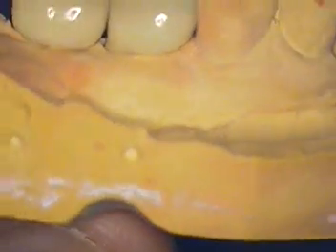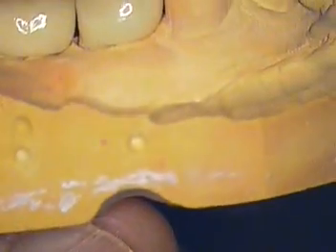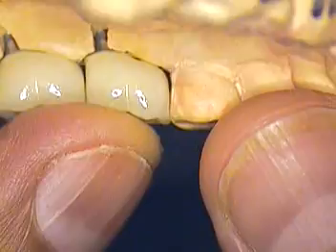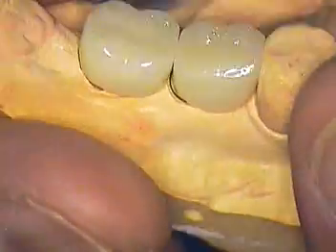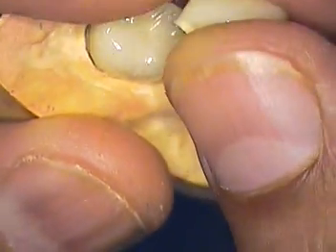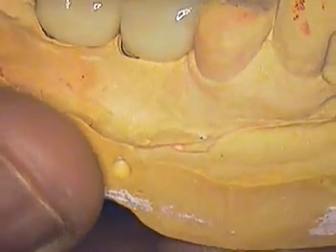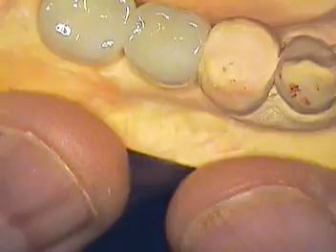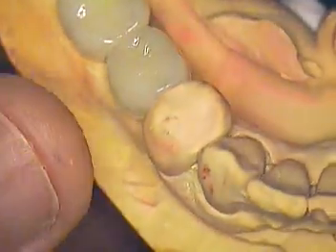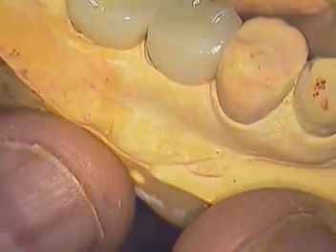Now if you look at the interproximal, you will notice that the embrasure spaces — this one might be a little too tight. This one looks more adequate. We might want the lab to open up that embrasure to allow better cleaning for the patient. It's kind of like pseudo-crown, pseudo-pontics, where you're dealing with a spatial relationship issue that becomes more of a discipline of how can we make this better for chewing and yet be supported by the implants.